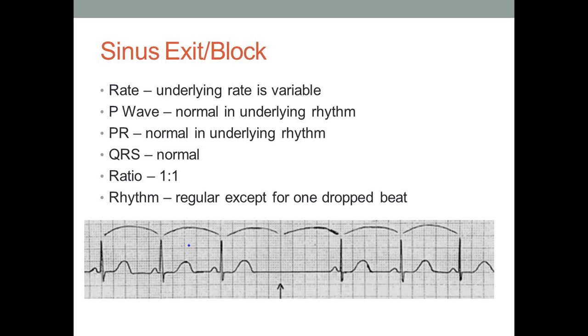And someone please remind me in our lecture, our class right before the midterm, I've got a quick little paper way of showing you if the rhythm is regular and if a beat has been dropped here. So someone please remind me of that and I'll show you how to do that. But again, the sinus exit and sinus block, it's obvious that only one beat here has been dropped. Everything else is normal.